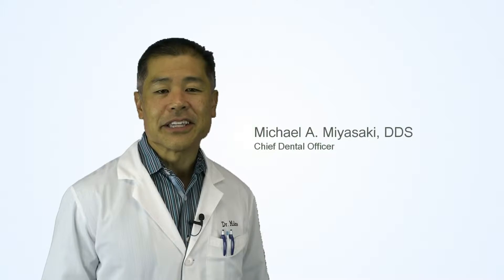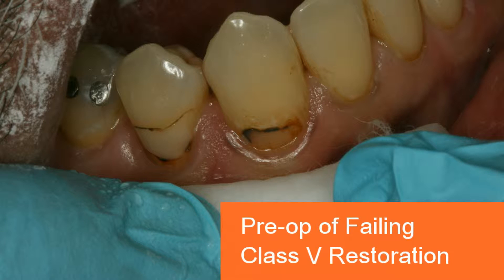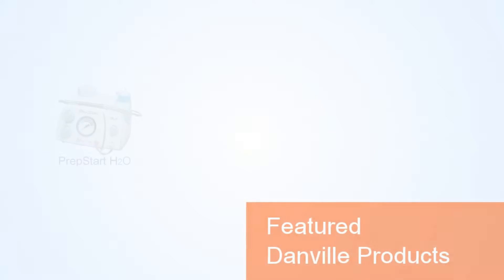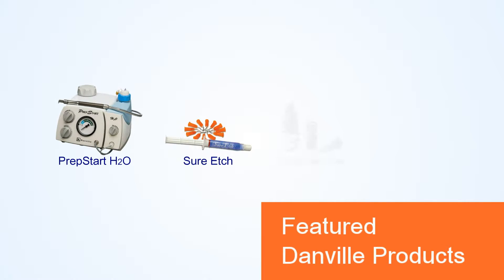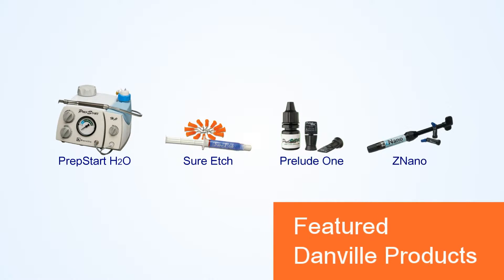Hi, I'm Dr. Michael Miyosaki, Chief Dental Officer of Danville Materials. In this short video, I'd like to demonstrate the restoration of a failing Class V composite restoration with recurrent decay utilizing the PrepStart H2O Hydro Abrasion Unit, 37% Phosphoric Acid Sure Etch Gel, Prelude 1 Universal Bonding, and Znano Universal Nanocomposite.